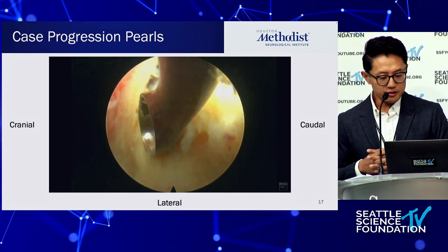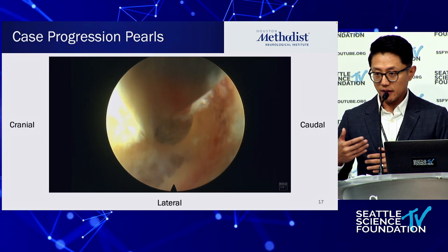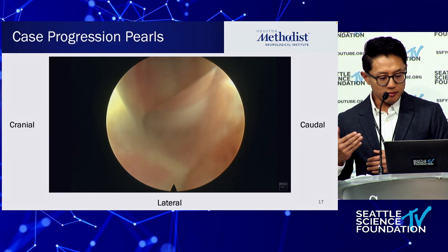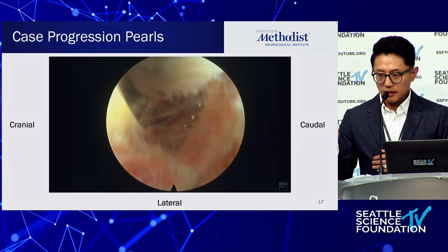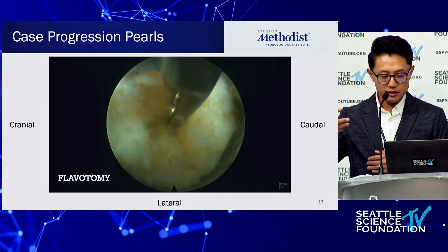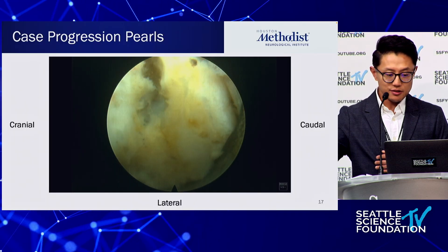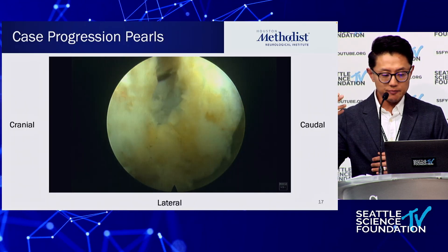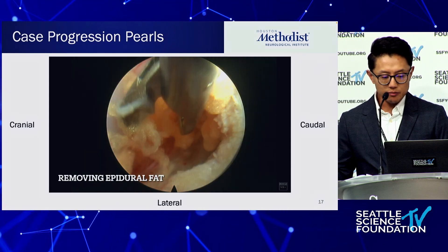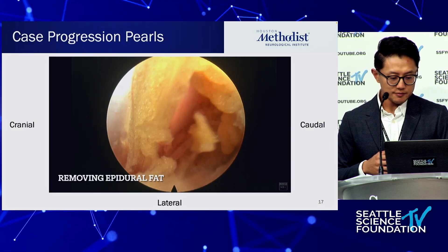This step is the same as what was just described — following the ligamentum flavum, just as you do in standard tubular or open micro discectomy cases. Use a curette to release that junction, then work all the way down and lateral to release all the ligamentum flavum. I typically open the ligamentum flavum medially first, because going from lateral to medial is harder to resect — it's much easier to go medial to lateral. Open a hole with scissor punches and resect the ligamentum flavum.